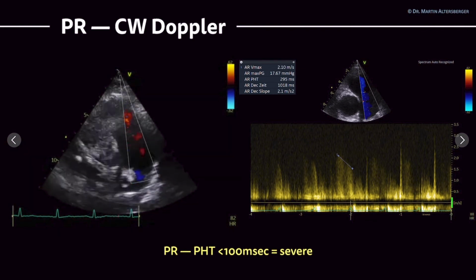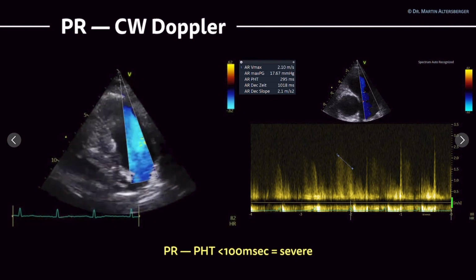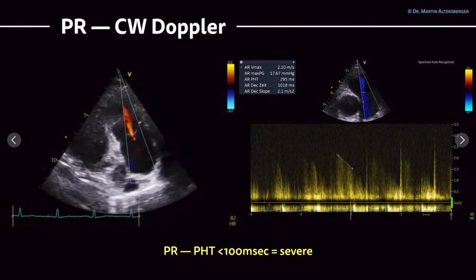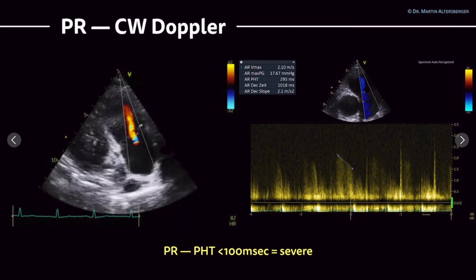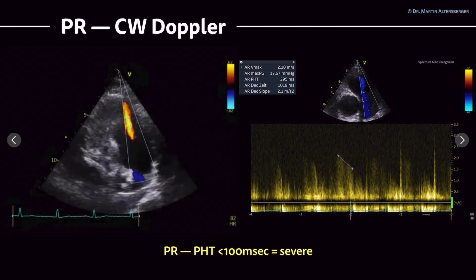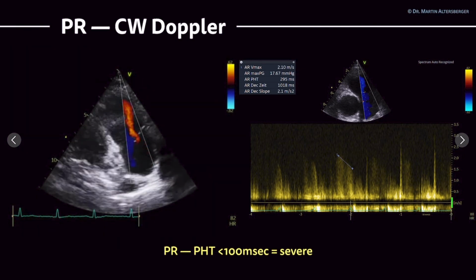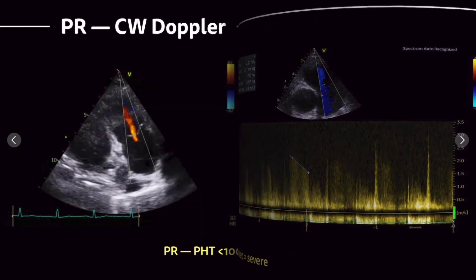Again, here's the limitation that this signal is sometimes very hard to get, and very often it's not as easy as you might want it to be to perform. So if you have a truly relevant regurgitation, then it's definitely important to perform this measurement, but again, then it will be way easier compared to simply mild regurgitations.